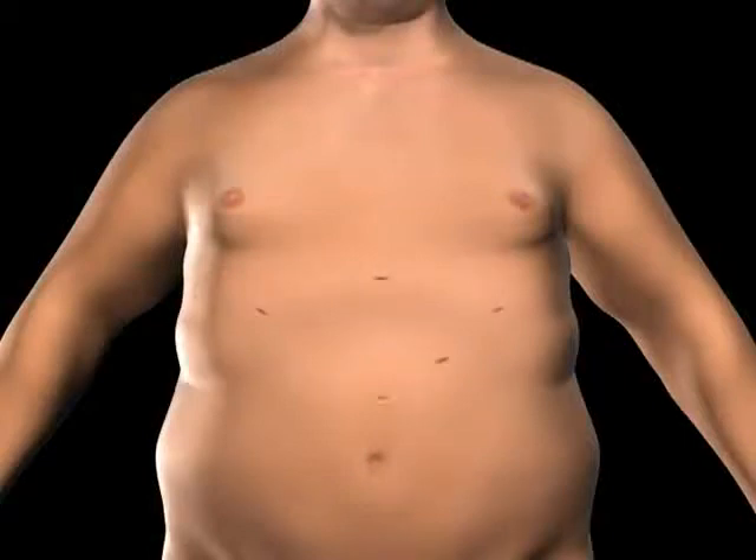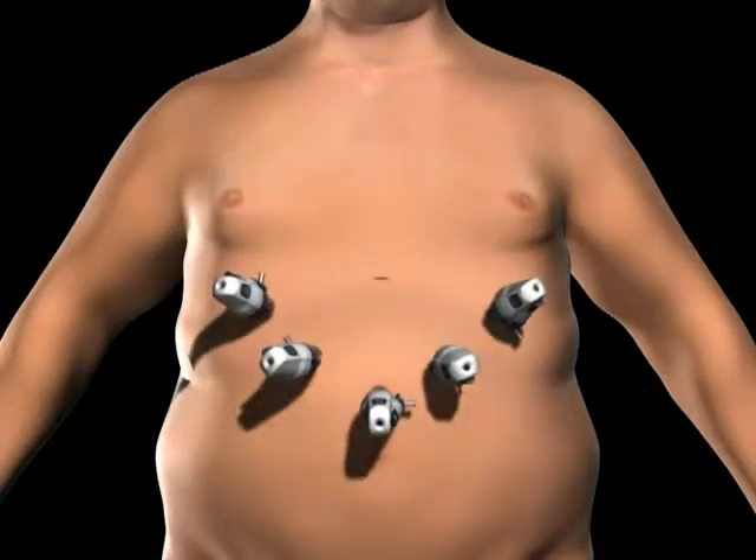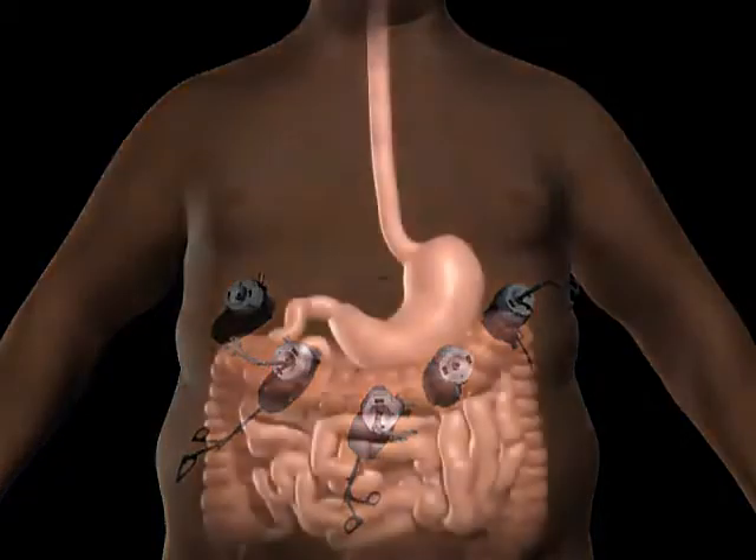Small incisions are created on the abdomen. Trocars, which serve as passageways for the surgical instruments, are placed into the incisions. Surgical instruments are passed through the trocars to access the abdominal cavity. The surgeon examines the abdomen using a laparoscope or video camera.